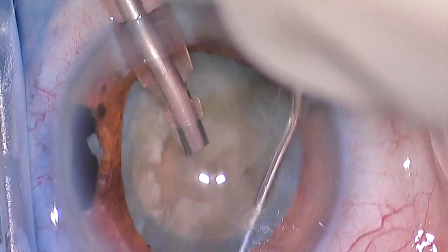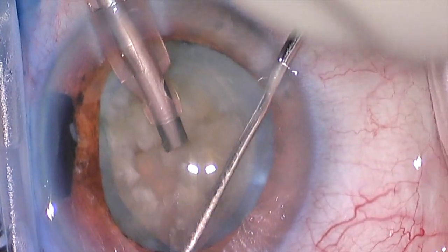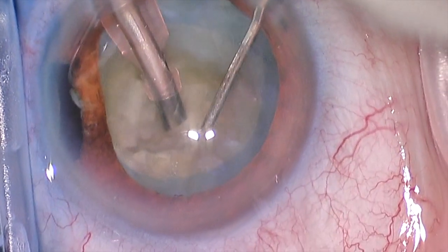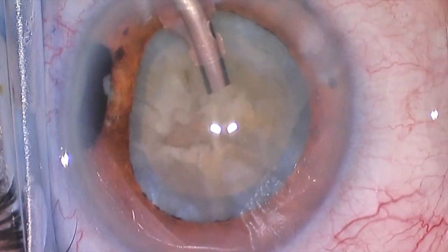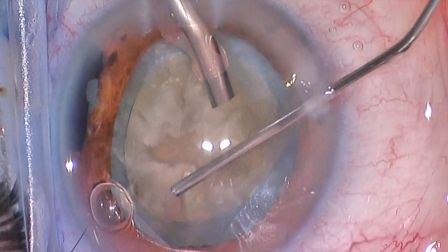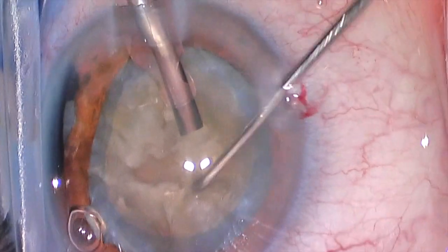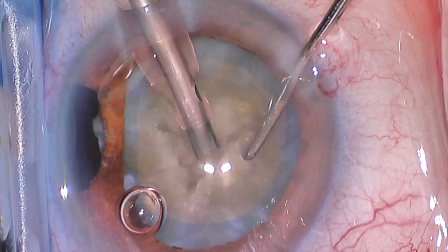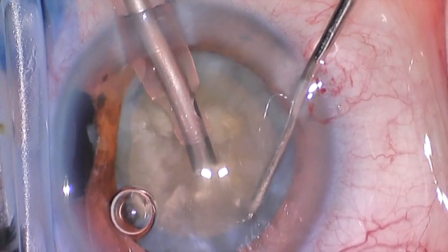The reason this technique and this type of lens requires quite a bit of patience is that if you're watching, it seems like not much is happening. Every time I bring those two instruments together and then separate them apart, it really doesn't look like we're making much progress. However, we're actually making a fair bit of progress. I will reinflate the eye with a little more viscoelastic — you can see those bubbles. Do keep an eye on the bubbles; we will use them to identify how much viscoelastic is in the eye. The bubbles are held in place by that viscoelastic gel, so they stick to the gel.